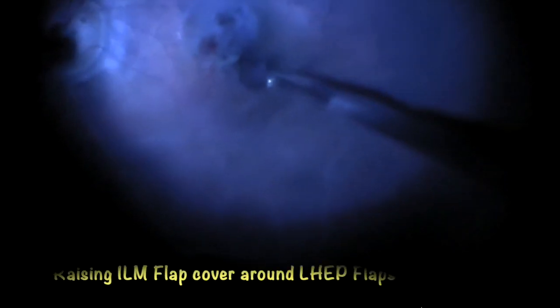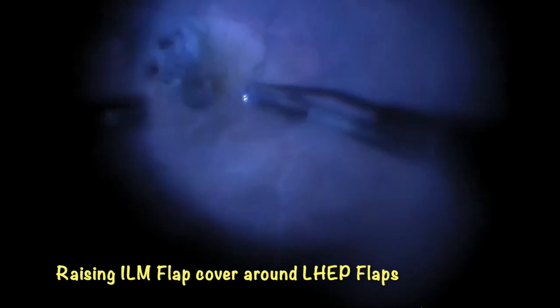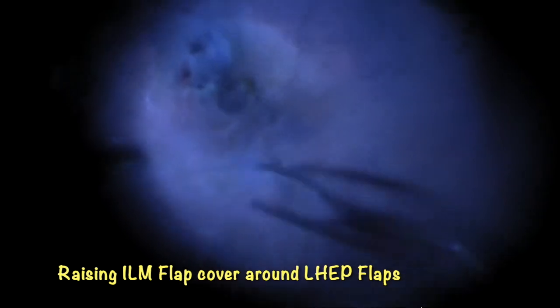Again, the rationale behind embedding lies in the origin of LHEP from the inner retina, comprising Muller cells and glial cells, which in turn produce trophic and growth factors for healing and thereby help in closing the defect.